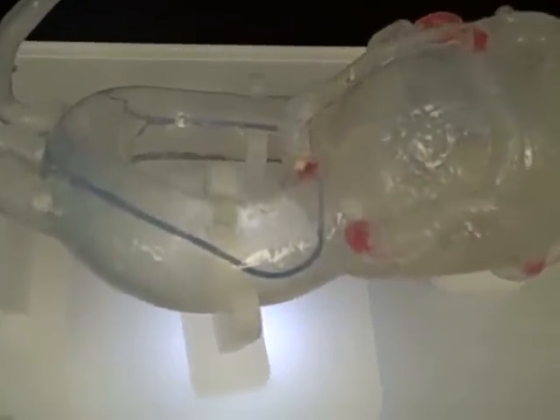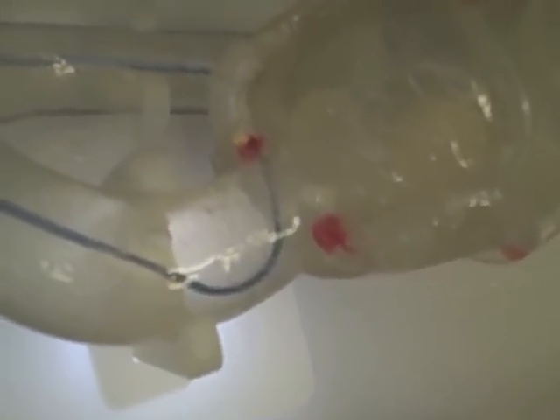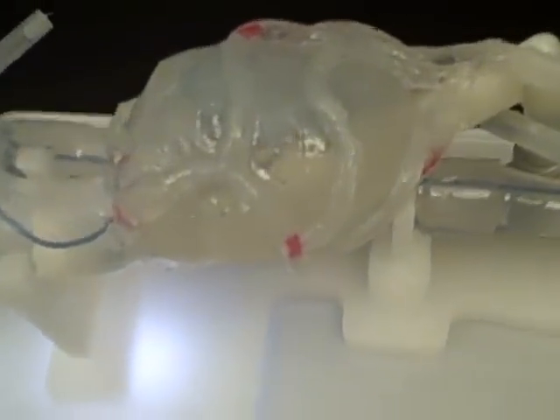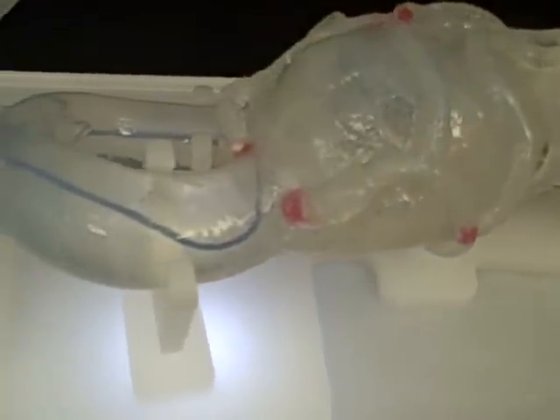Here's a guiding catheter inserted into the model and it's actually in the left coronary. The red marks on the two mains are actually targets for getting into the left and the right takeoffs. And then also throughout the left and right coronaries are different lesions. Lesions can be placed anywhere in any size stenosis.